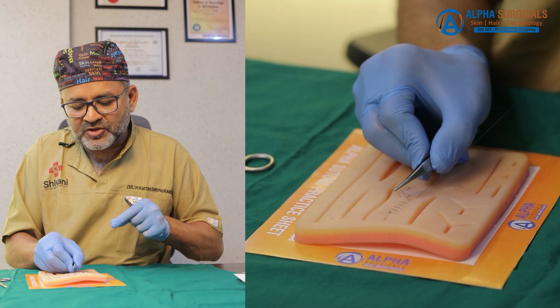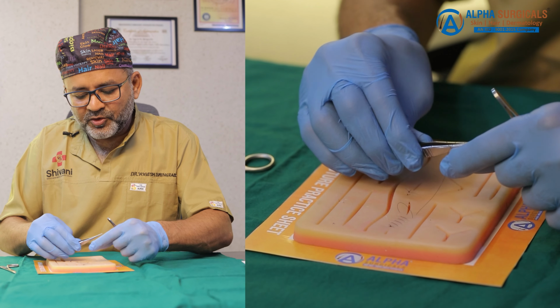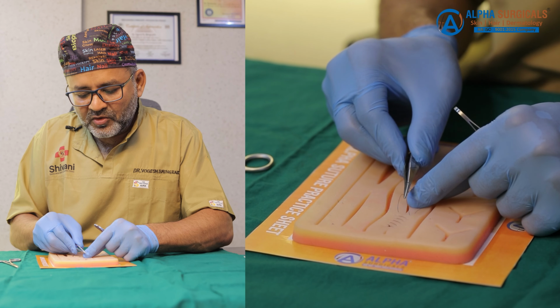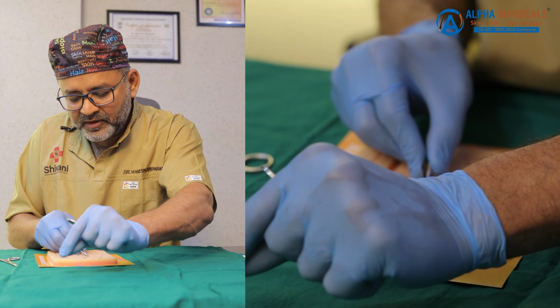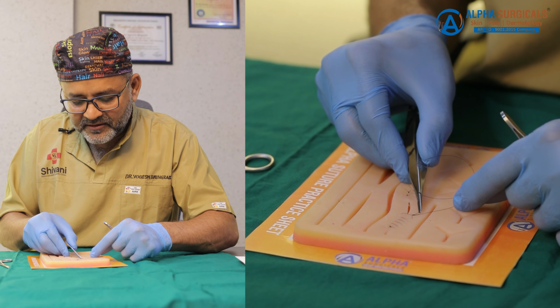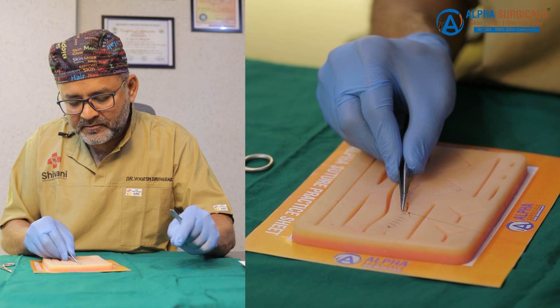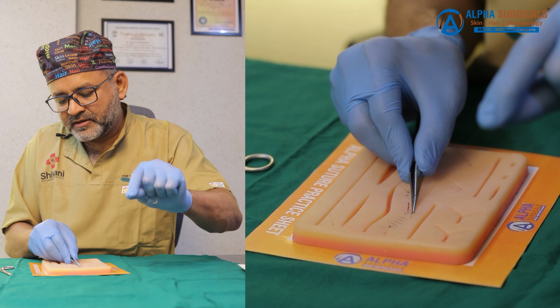So this is the last loop and I will be using it as the second end of the thread. Here we are putting 3 loops, holding the loop and giving closure. So this is the last tie.